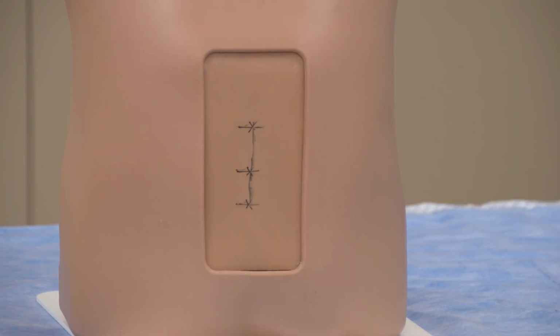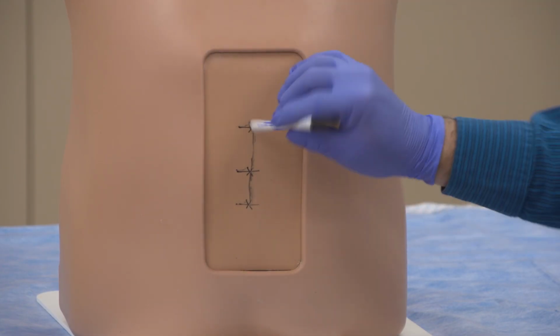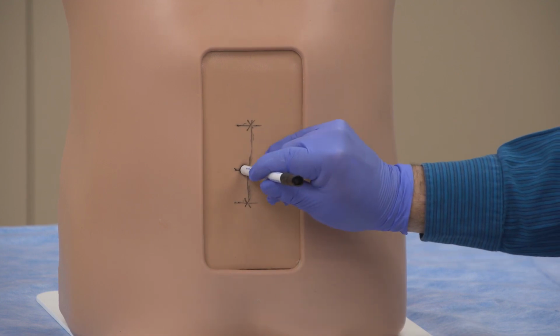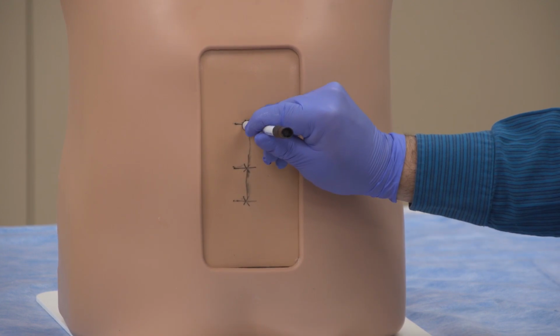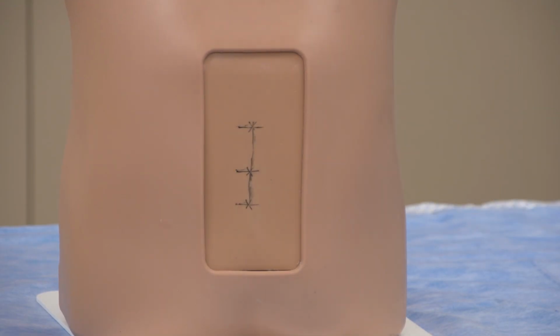It is helpful to create a gentle indentation using the blunt marker cap at the L4, L5, and L3, L4 midline interspaces. This ensures you maintain your mapped and marked needle insertion site through the process of skin cleansing. Lastly, we will visualize the ligamentum flavum and dural complex to estimate needle insertion depth using several methods.